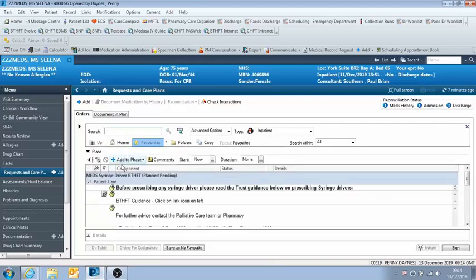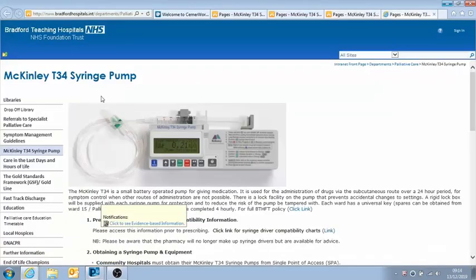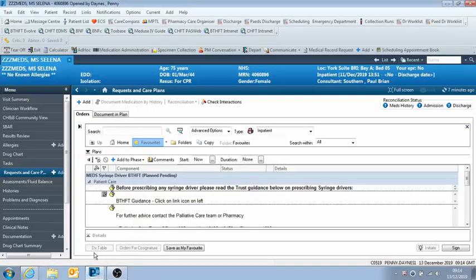And then the first thing you can do with a power plan is there's a little note here that links to the BTHFT website, the intranet, and this brings up any guidance that there is on the power plan. Okay, then you can just go back into the patient here.